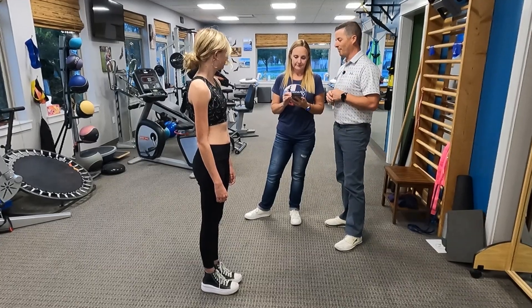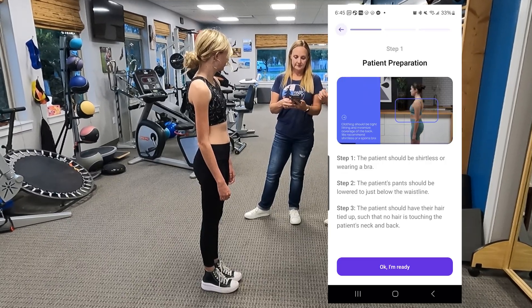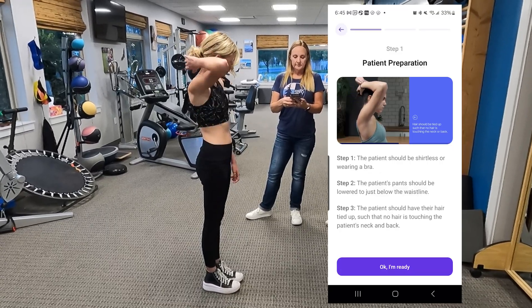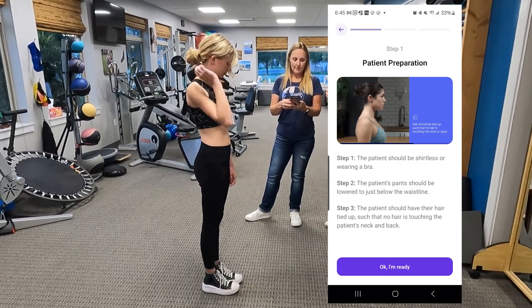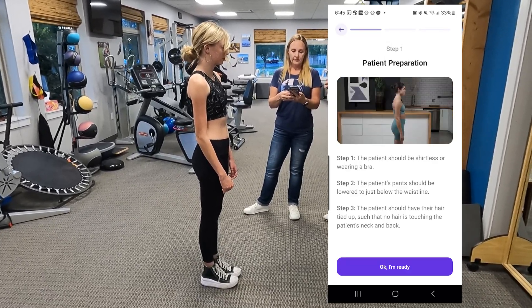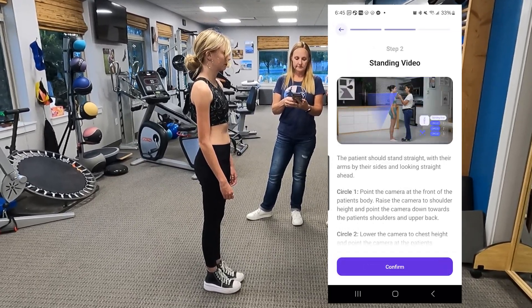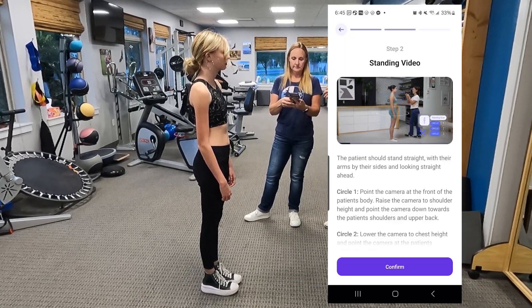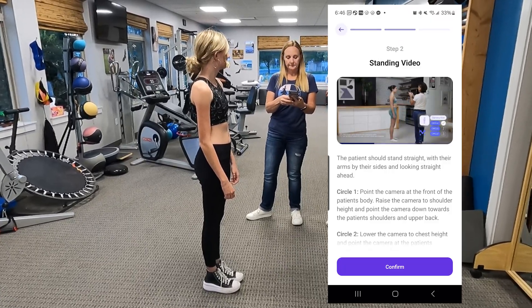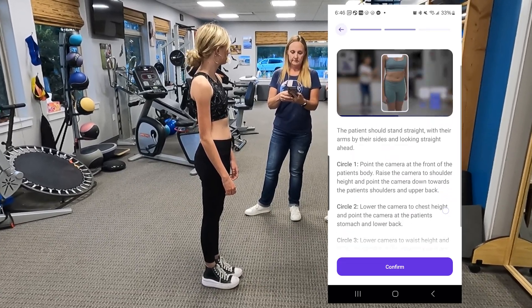Dion is going to open the app. We select Addie, and then it will describe a little bit about what you want — hair up, where your clothes should be — so that we get a good scan. Just follow the directions and be in a space where you can go around somebody. Then you click 'OK, I'm ready.' It will describe Circle 1, Circle 2, and Circle 3. Circle 1 is at the shoulder level, Circle 2 is at chest level, and Circle 3 is at the waist level.